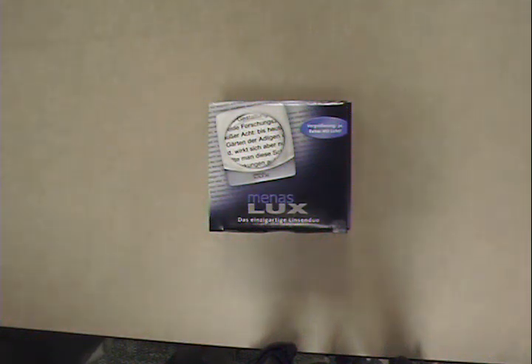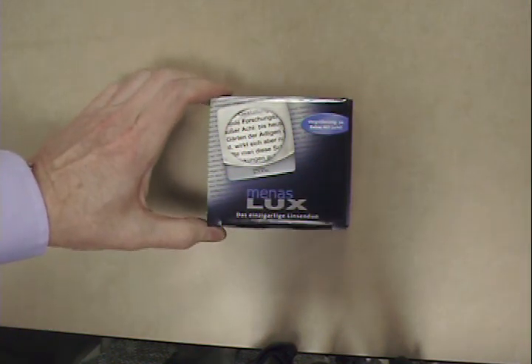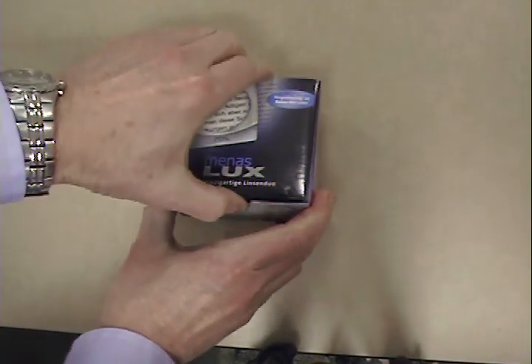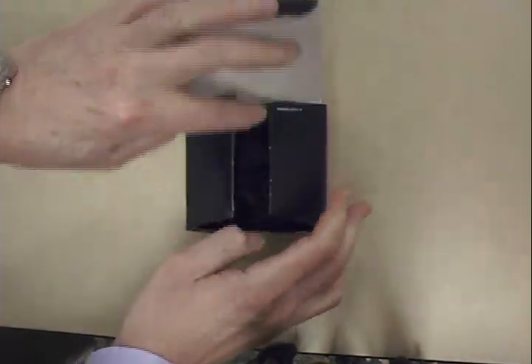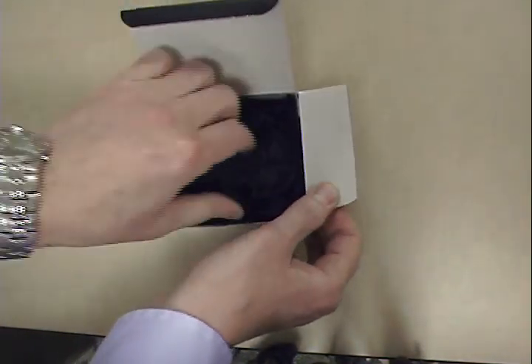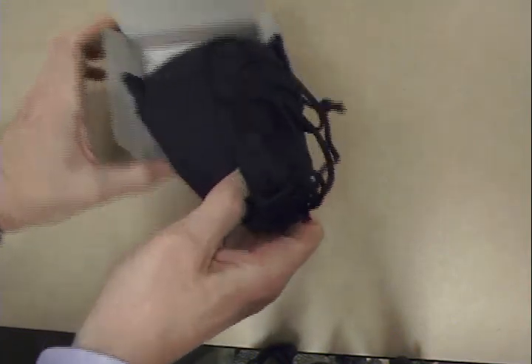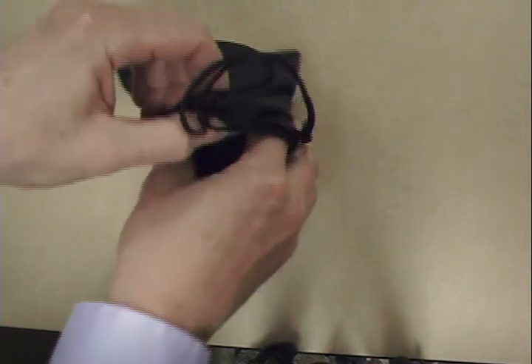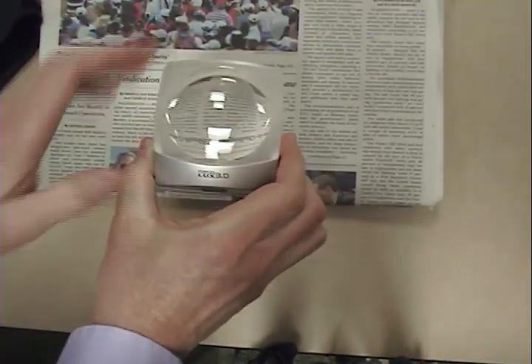I would like to introduce the menas LUX, a compact illuminated stand magnifier in a contemporary design. The menas LUX provides 3x magnification and features a wide 63 millimeter or 2.5 inch diameter lens that provides a generous field of view, so patients will be able to see more text or images at one time.